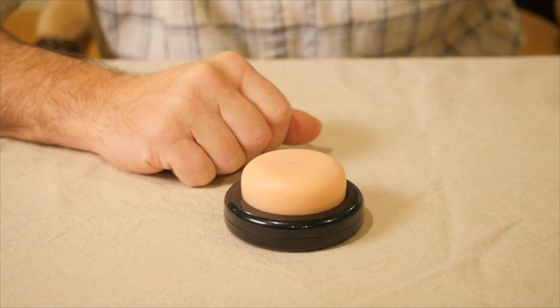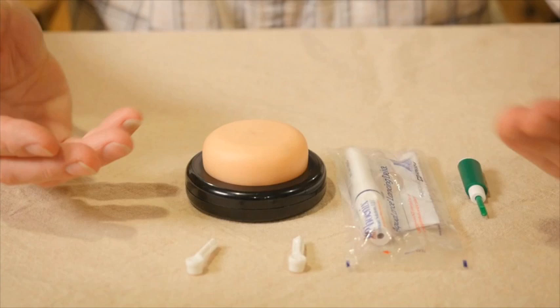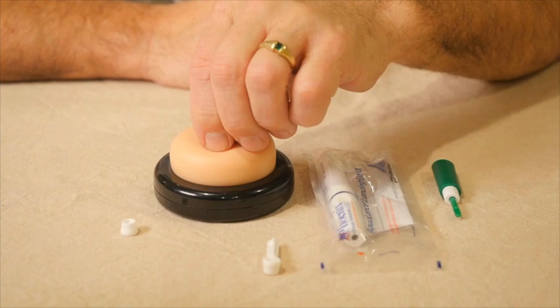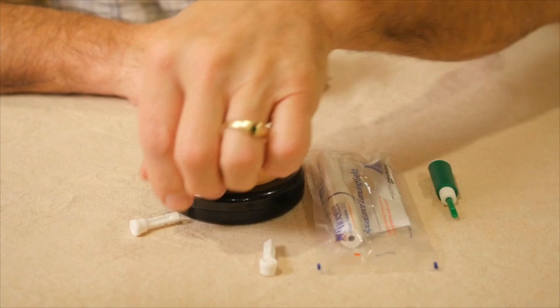Nowadays, we want to use single-use disposable needles whenever possible, so we generally use a lancet. Lancets are easily available and simple to use: take the top off to expose the needle, make the insertion to get the blood out, then recap it carefully one-handed and place it in a biohazard container.